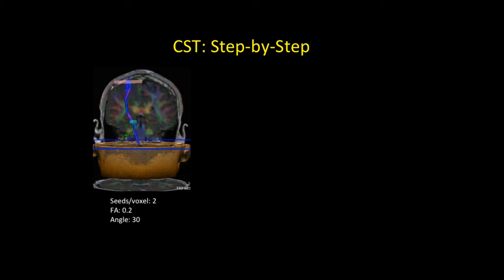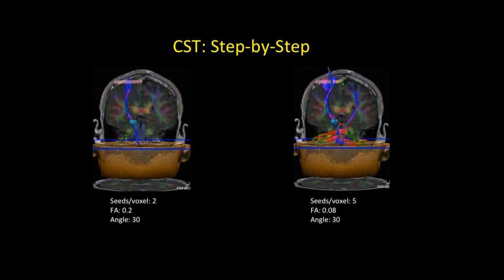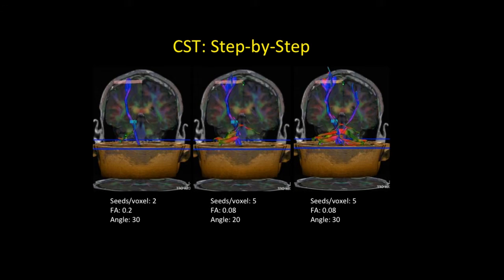Once we have a track, we should fill it out or make it more robust by altering the DTI thresholds on our software. Decreasing the FA equals more streamlines, and increasing the angle also gives us more streamlines. We don't want a single twig or too many spurious fibers, so a happy medium is our goal that should match what we know white matter dissection atlases show us.